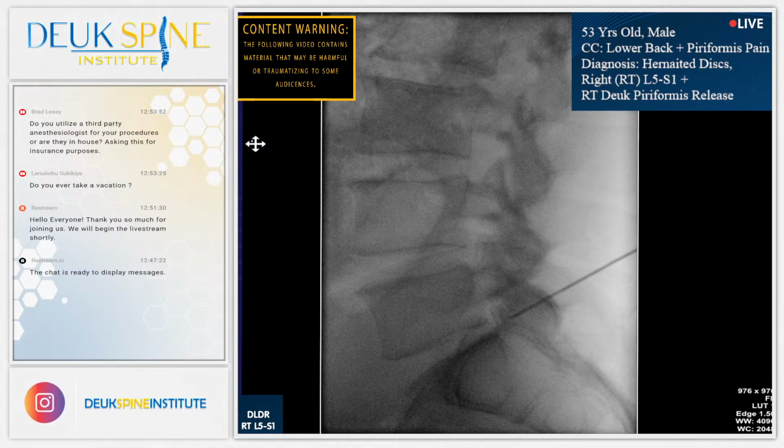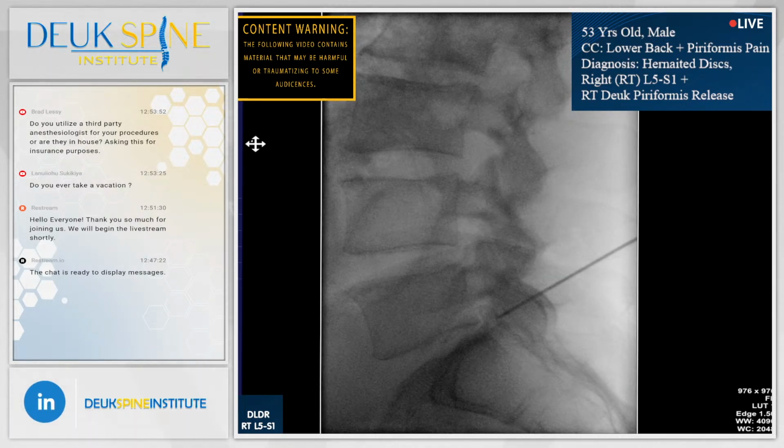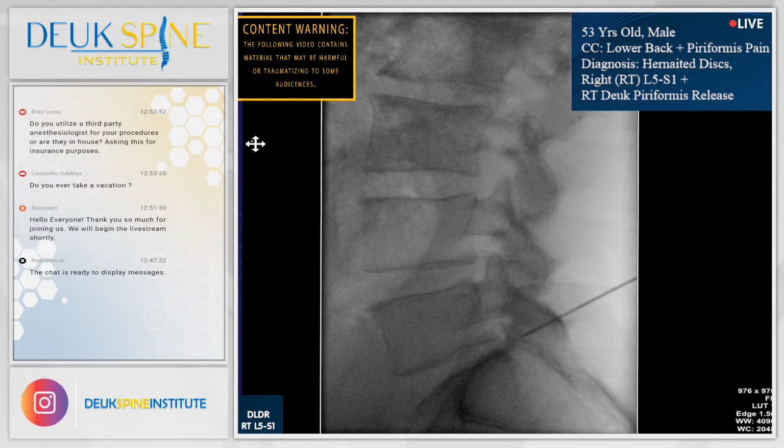That's better right there. But I think we're off on orbit by 1 degree, maybe. What I'm doing, I'm working with my x-ray technician who uses an x-ray machine to show us the spine and the needle. I think you went the wrong way on the orbit. And what he's doing is he's getting a perfect lateral view. All right, now that's almost 100% perfect. I think we're off just a smidgen on the WAG, or actually the orbit and the WAG by half a degree. Shot. That's good on both. Actually, that's as good as it's going to get.